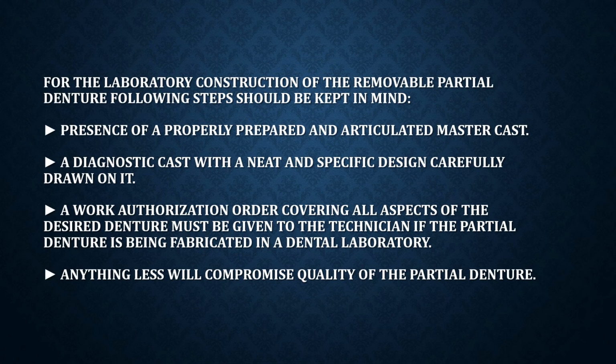For the lab construction of the removable partial denture, the following steps should be kept in mind. First, the presence of a properly prepared and articulated master cast. It doesn't have to be articulated all the time, but you require a proper master cast. In some cases, they do send an articulated master cast. Second, a diagnostic cast with the neat and specific design carefully drawn on it.